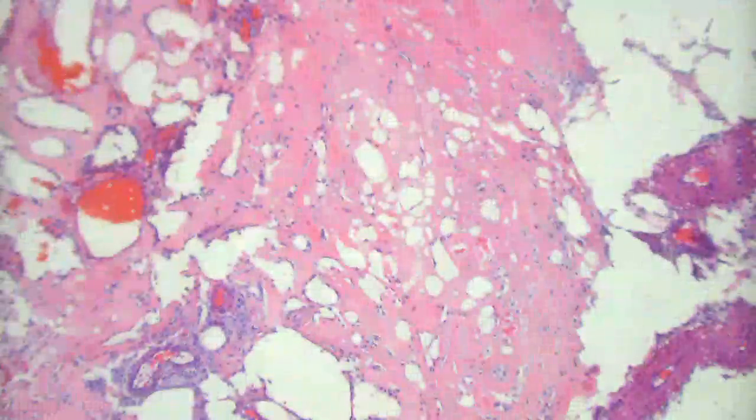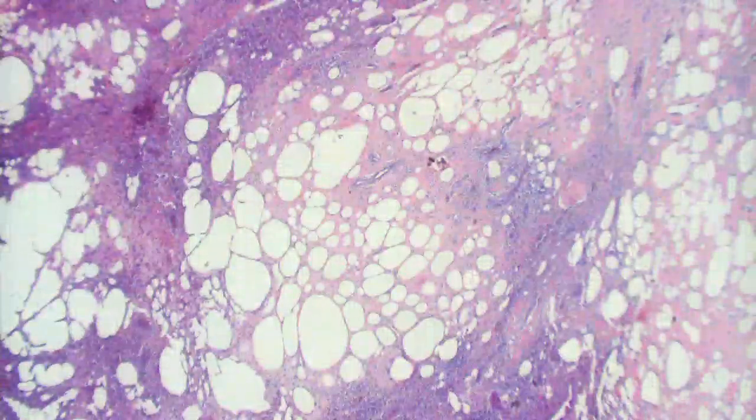But it seems like infectious things can cause ulcers, and a vasculitis with it. They can. But you're right, LCV also causes ulcers, and clinically we suspect LCV whenever we see ulcers. Although this isn't really good for LCV, is it? It's a deep ulcerative process with a sharp punched out ulceration and probably got some secondary bacterial, maybe fungal contamination in it.